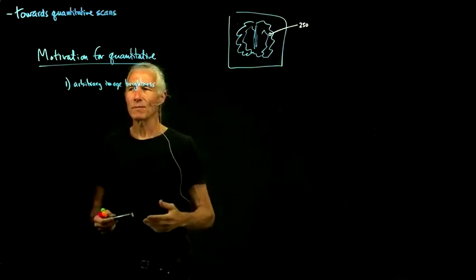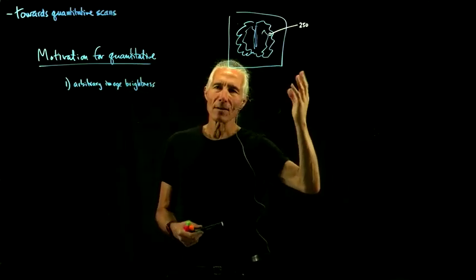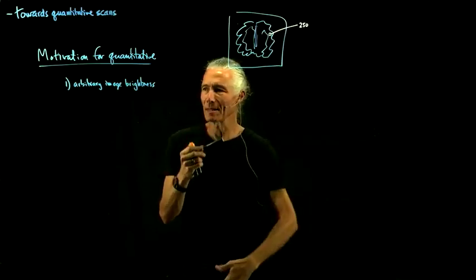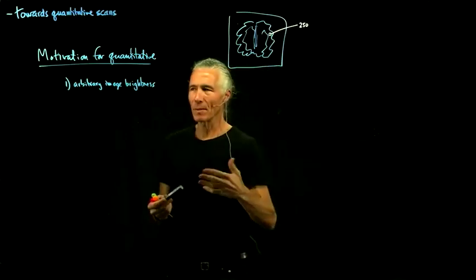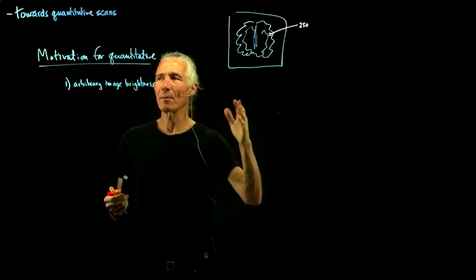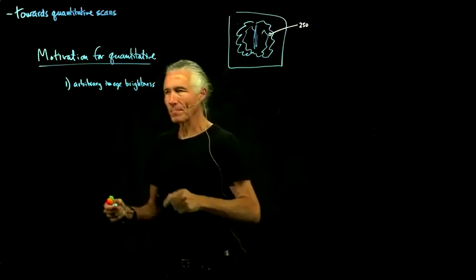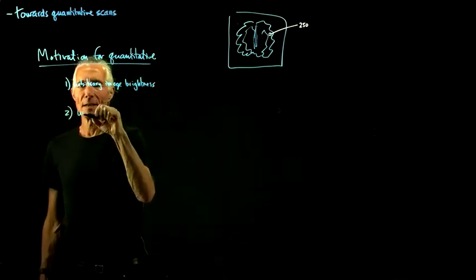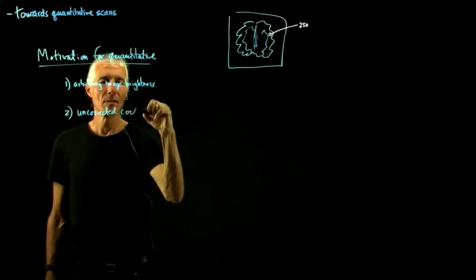So if you're comparing to another scanner or a scan on a different day, you have to normalize things and make certain assumptions about the contrast in order to make some comparison. And that's how most research is done. Like 99.9% of research is done that way. But there are several other problems, and two of the big ones are uncorrected coil fall off.